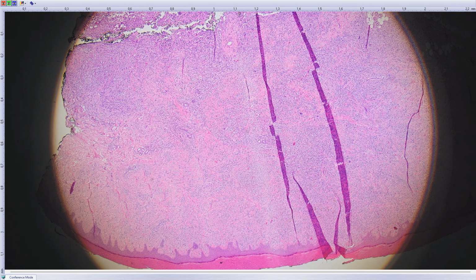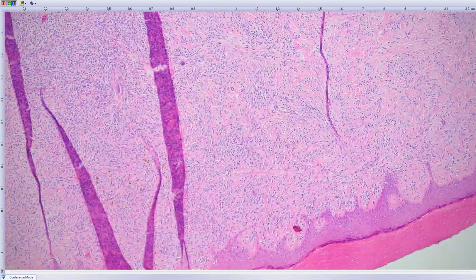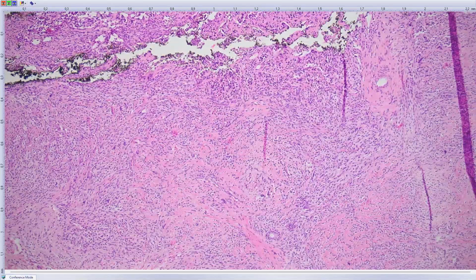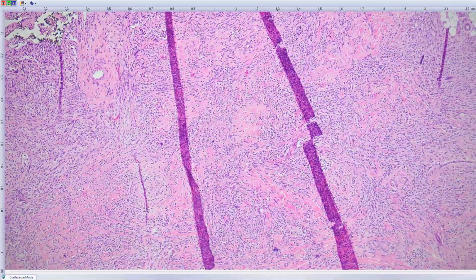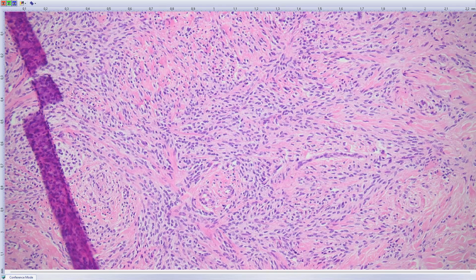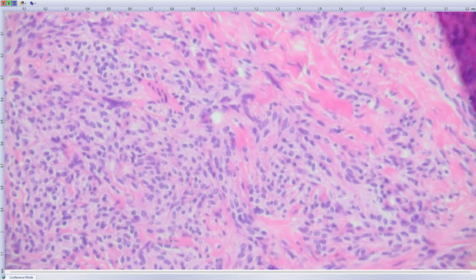So this is a 9-year-old boy, with a lesion on his hand, on the finger. And we see a skin excision, normal epidermis, but right beneath the epidermis starts this spindle cell proliferation, where I believe many differential diagnoses are possible. Any suggestions? What would you think of, or what stains would you do? Spindle cells quite uniform.